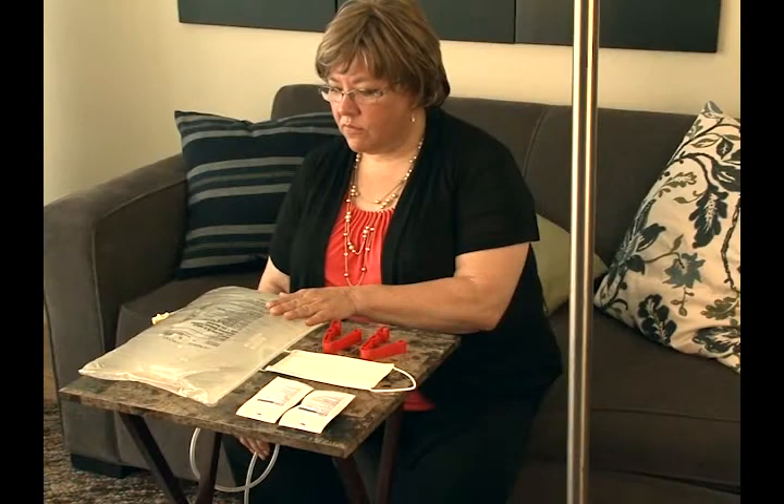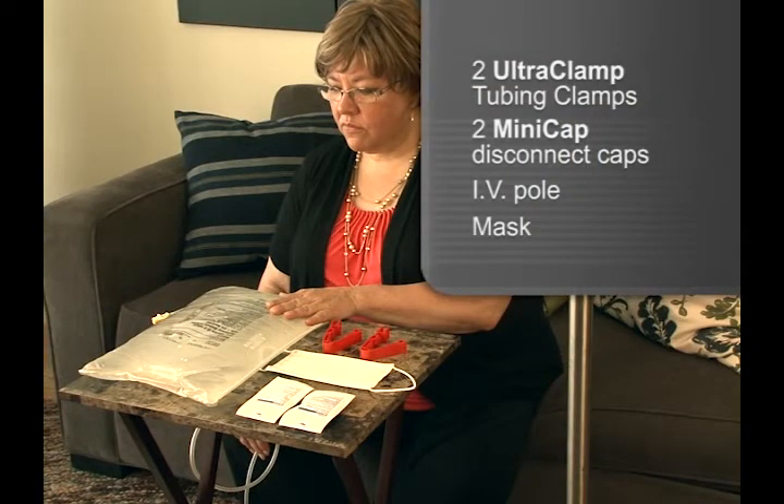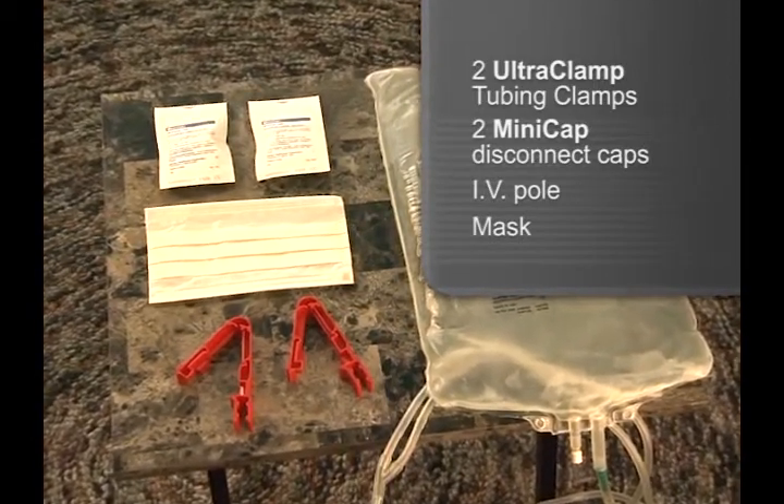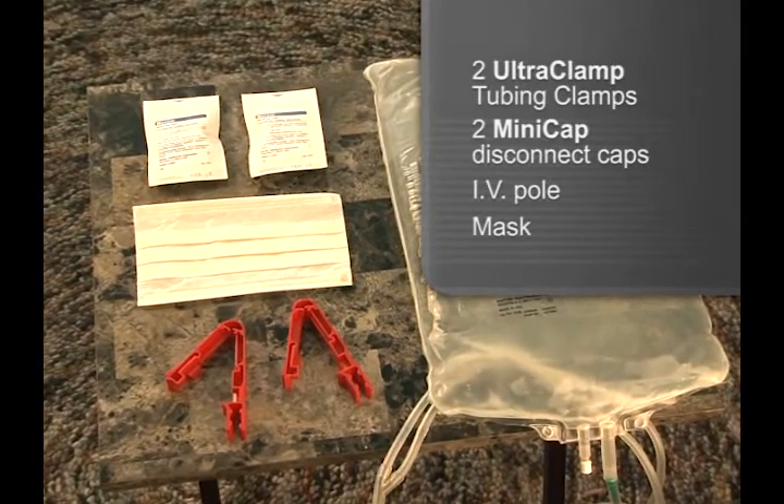Also required for this procedure are two UltraClamp tubing clamps, a new MiniCap disconnect cap, an IV pole, and a mask. Your dialysis nurse may recommend having two MiniCap disconnect caps available during your exchange.